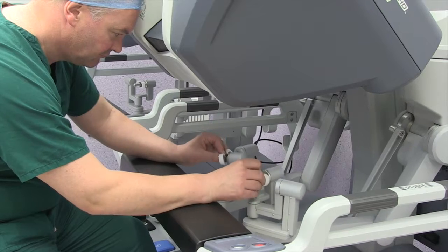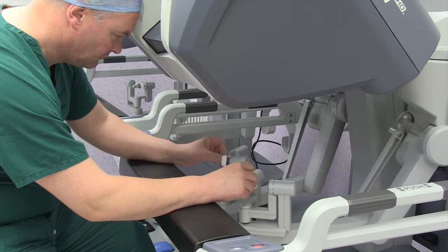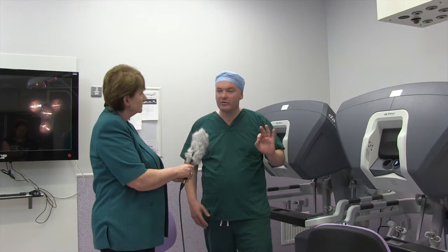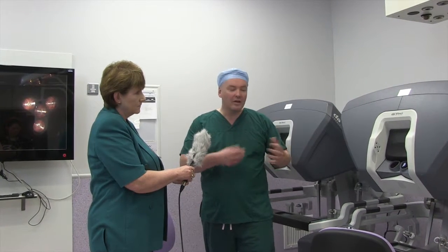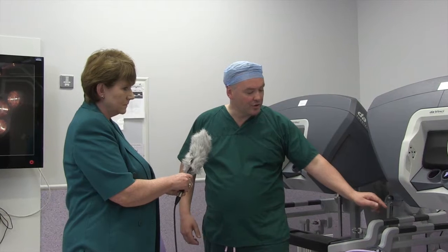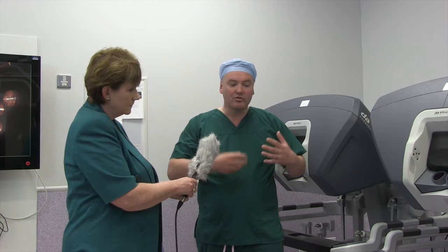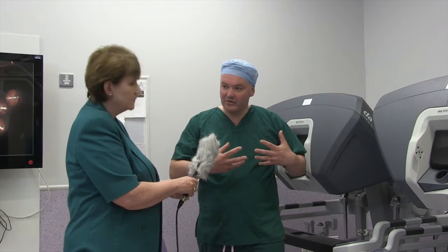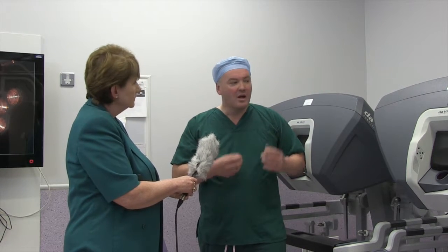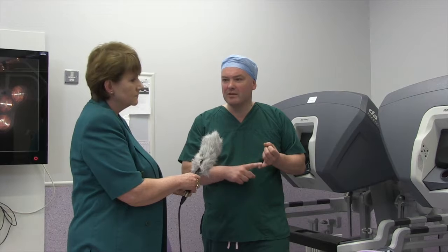Here at Stepping Hill we've invested in what we call a dual console system. The idea is that a surgeon can sit and look into these consoles and have a 3D view of keyhole surgery inside a patient. Rather than have to hold the instruments and get fatigued and tired, we operate the robotic arms, as I showed you a second ago, via small handpieces. That would allow us to control very, very fine movements on the inside, movements that traditionally would have left potential surgical tremor. That plus the expanded, magnified view allows fine operating on very delicate structures.